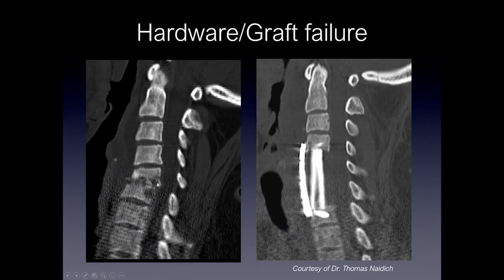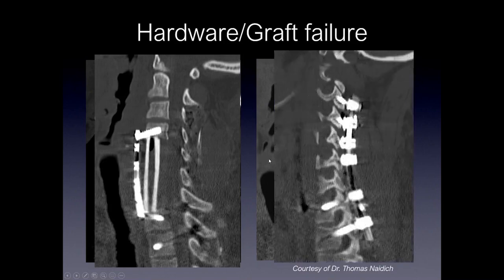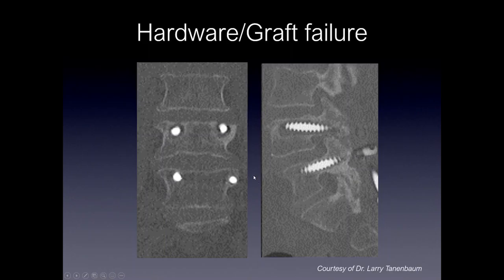Here's another example where a patient had discitis osteomyelitis and ultimately underwent a corpectomy for treatment with a fibular strut graft. On follow-up imaging, the plate was pushed ventrally or anteriorly away from the vertebral body, ultimately requiring surgery and posterior fusion. In another case, you can see lucency around the screws consistent with hardware loosening from a failure of fusion.